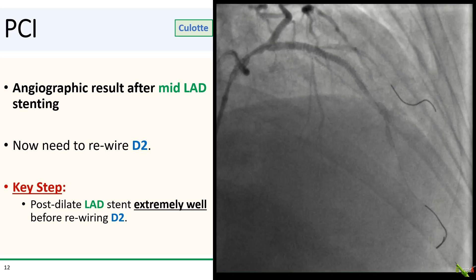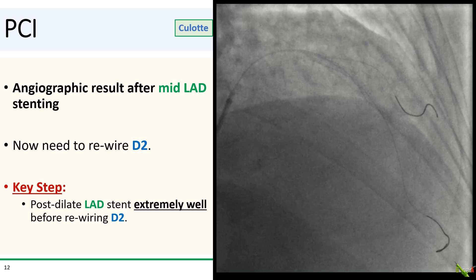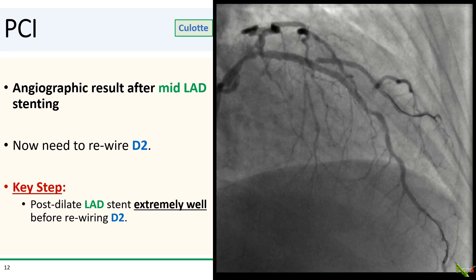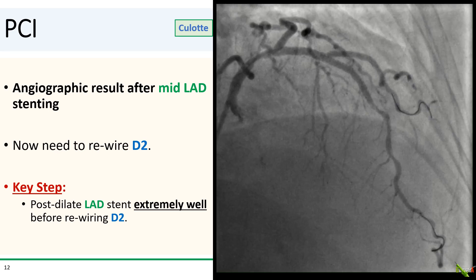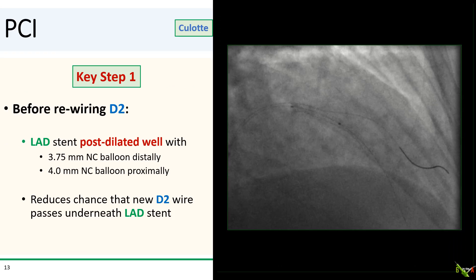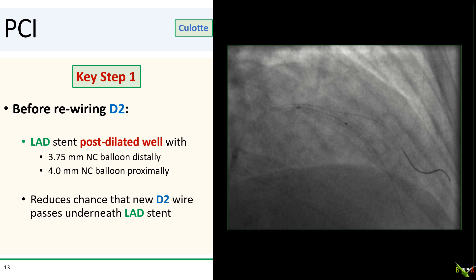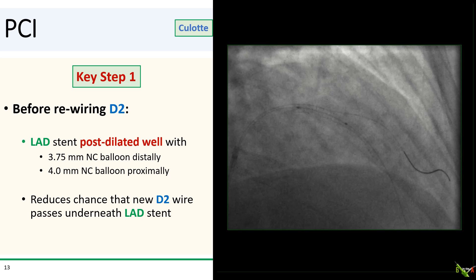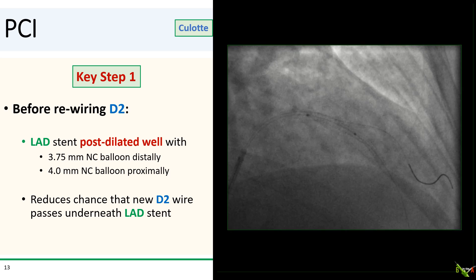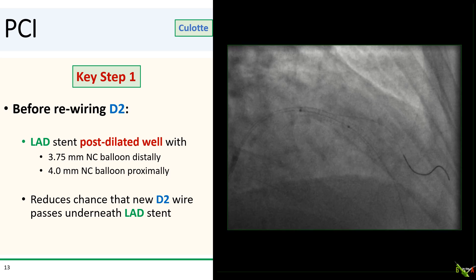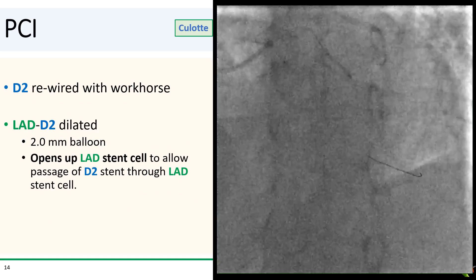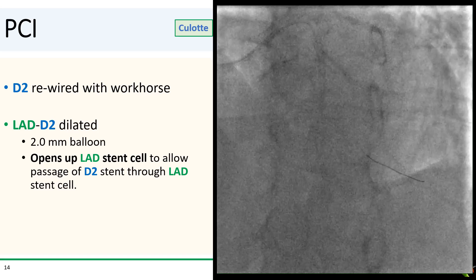Here is where we are after stenting the mid-LAD — not too bad. We now need to rewire D2, but this is key: remember to post-dilate the LAD stent extremely well before rewiring D2. We post-dilated the LAD with 3.75 and 4.0 mm NC balloons. Post-dilating the LAD stent before rewiring D2 reduces the chance that the new D2 wire will pass underneath the LAD stent. After post-dilating, we easily rewired D2 with a workhorse wire.